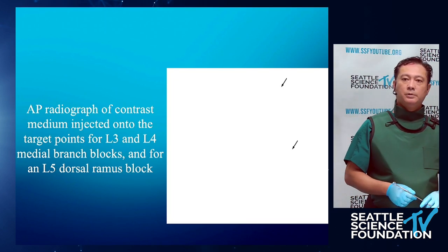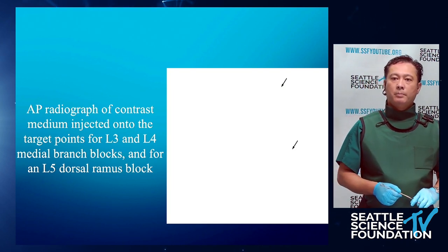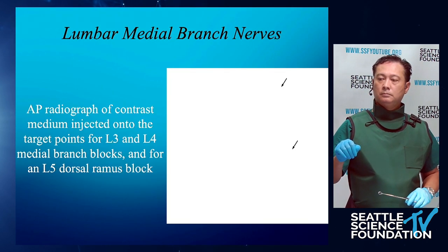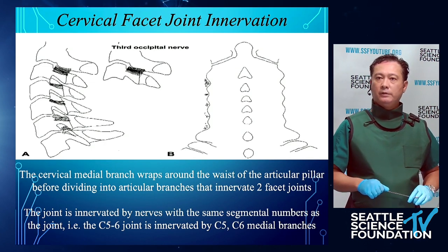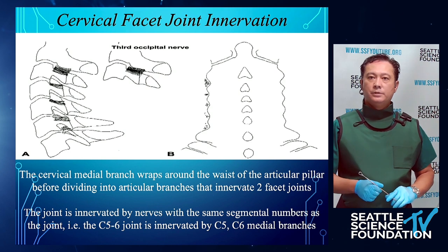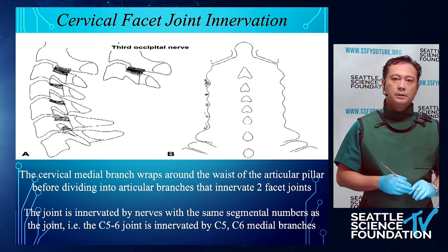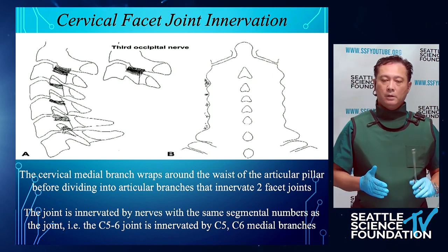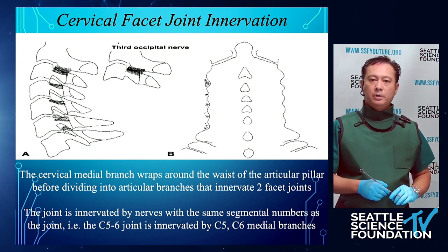Looking at an AP radiograph of contrast medium injected onto the target points of L3 and L4 medial branches, and for the L5 primary dorsal ramus. Looking at the cervical medial branches at the C2-3 facet joint level, we can see the pattern of where the actual nerve is located and the best area for us to target that nerve, right at the C2-3 joint line. For C3, C4, C5, and C6, we're looking at the middle of the articular process.